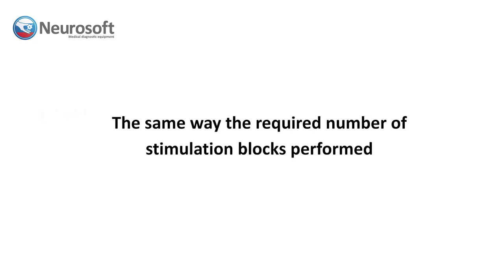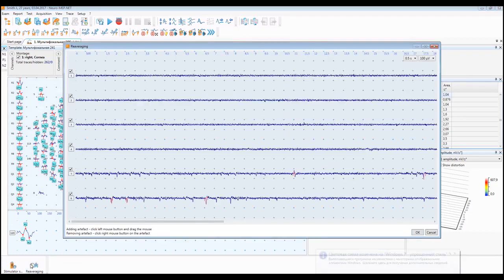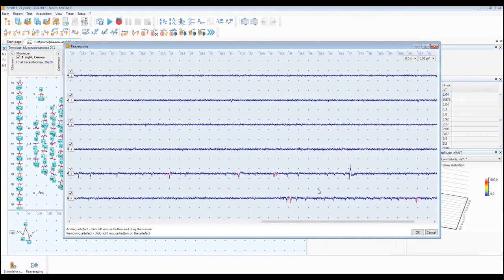Please don't blink. Thus we have finished all stimulation cycles and obtained the array of average traces and the topographic map of responses. We can estimate the quality of the obtained raw traces and remove the artifacts by pressing Reaveraging button. Here we can see all native traces. We can see a lot of blinking artifacts. We can remove them, and the program will exclude them from averaging and make the required adjustments.